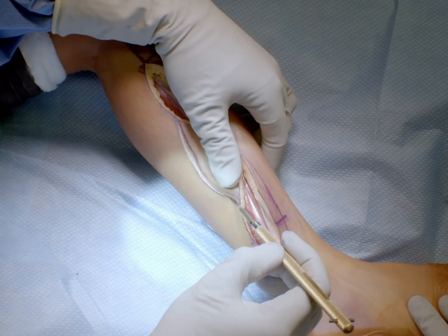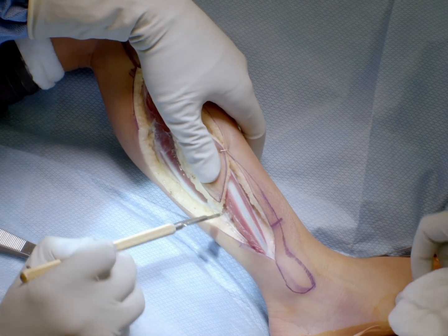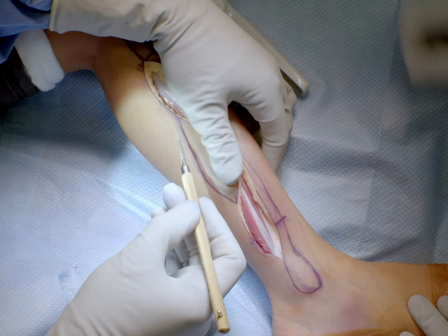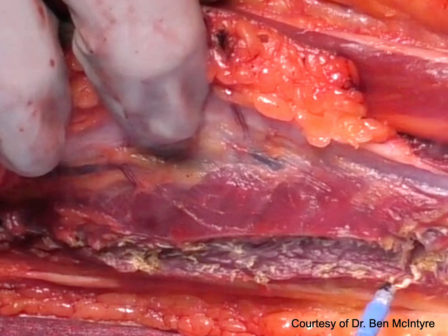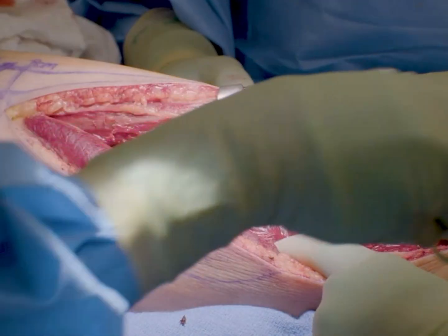If a skin paddle is needed, the posterior skin incision is made now. The dissection is carried down to the soleus muscle, the fascia is opened, and the skin paddle elevated anteriorly, protecting the exposed septal perforators. If intramuscular perforators are needed, they are identified and preserved at this stage — several may be found. If muscular perforators are needed, they are harvested with a cuff of soleus muscle around them. If a skin paddle is not needed, the perforators are ligated.